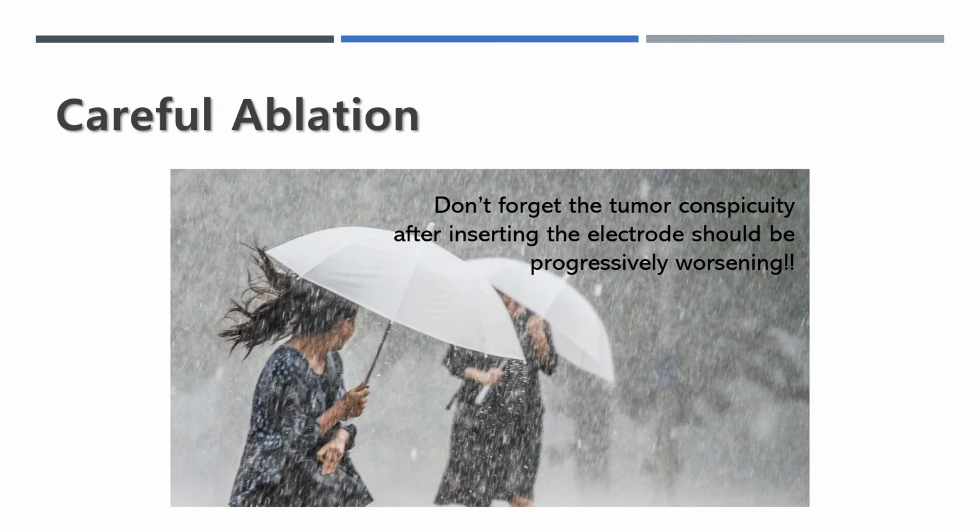In addition, respiration is also an important hurdle for accurate placement of electrode into or adjacent to the tumor. So, if the tumor is only visible at fully inspirated state, we should be more careful to pull back from the index tumor even after accurate placement initially.